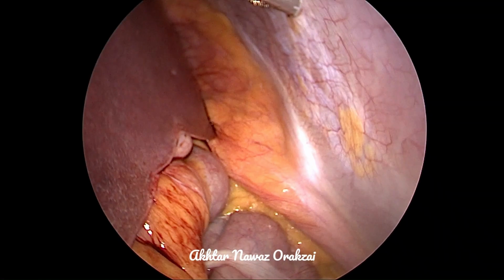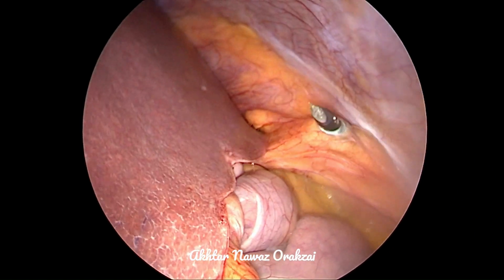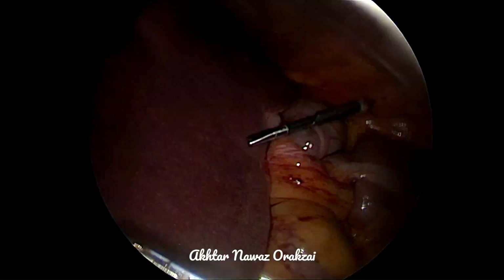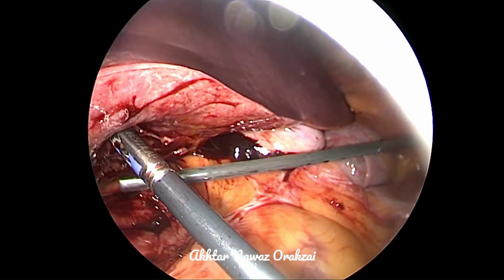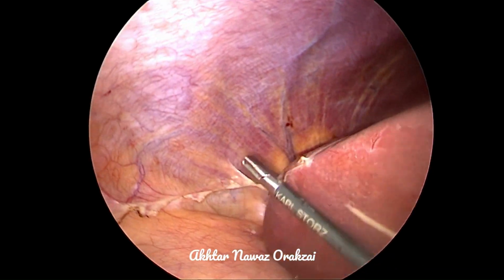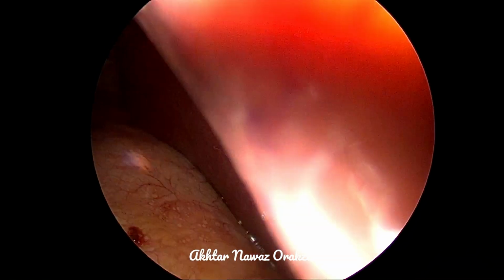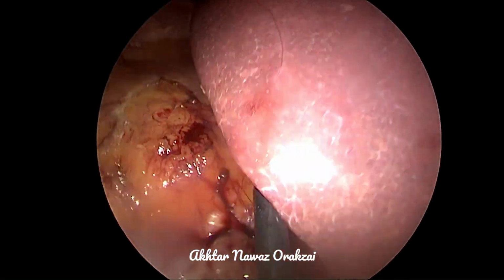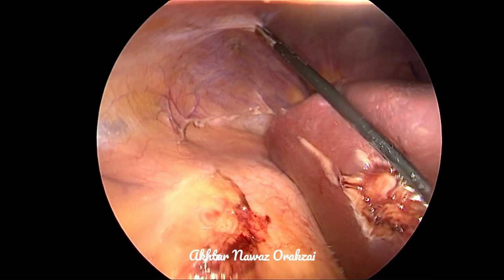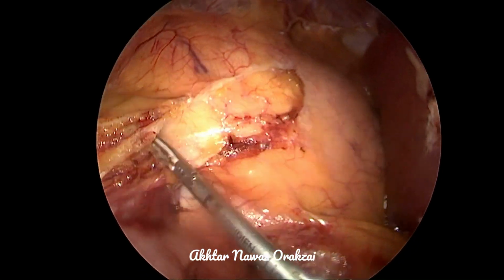So we place a port in the epigastrium, retracting the colon medially so that it doesn't get in the way of the trocar and get injured. And then we place a self-retaining Alice's forceps below the liver, which can be attached to the diaphragm. So we reposition it so that good space is available for dissection. And now we can see that the kidney is visible.